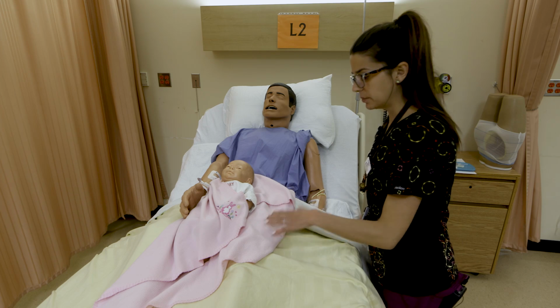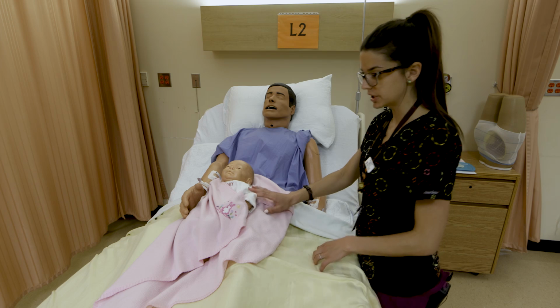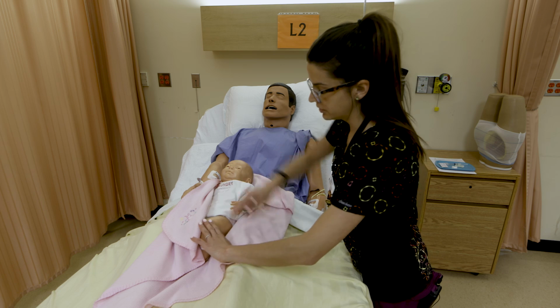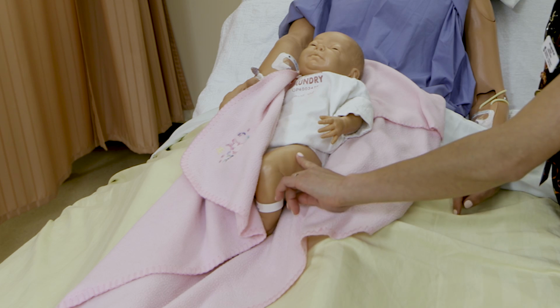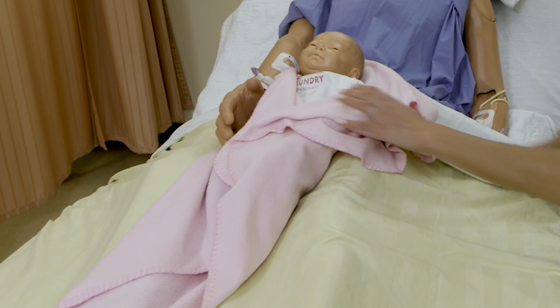And for a baby, vastus lateralis is actually the most common site for injection too. Obviously putting your hand width wouldn't really work, so you could just do a 2-finger width marking, and then it's going to be that middle muscle section on a baby as well. So that's the most common site for an infant.